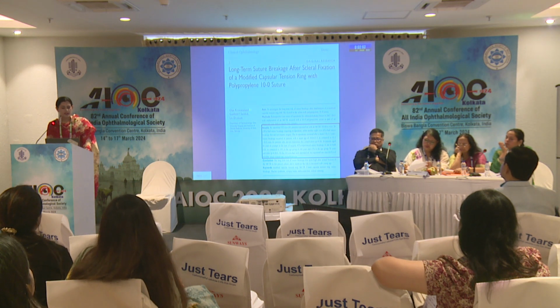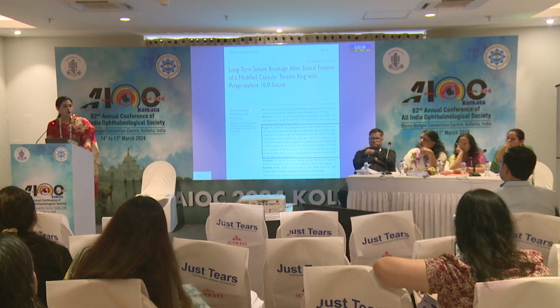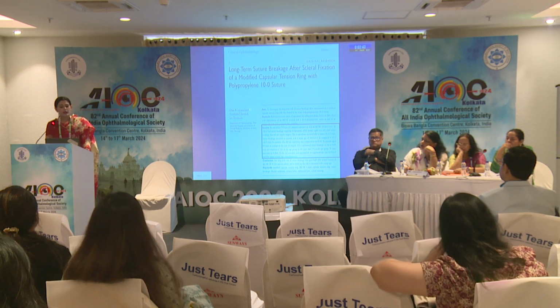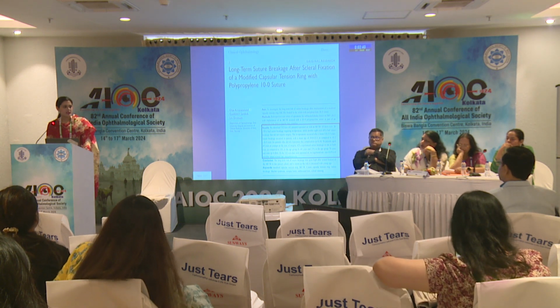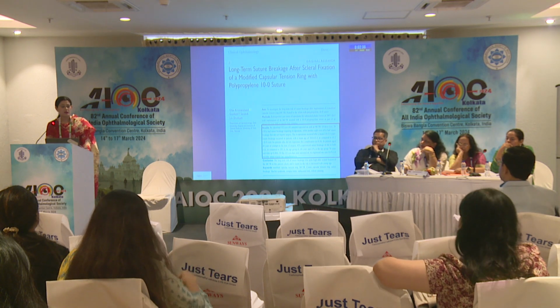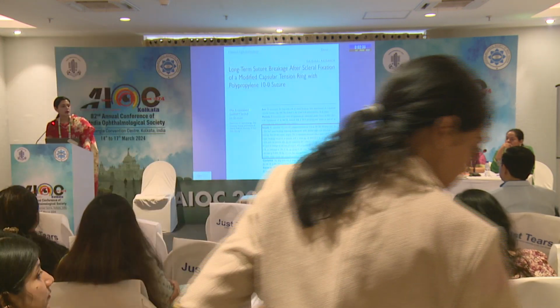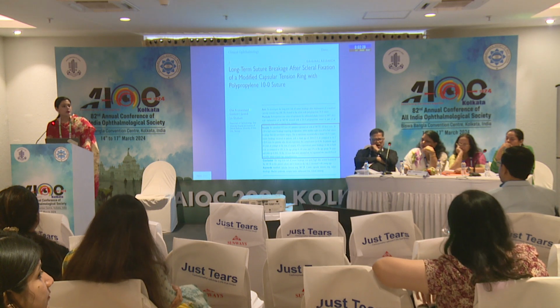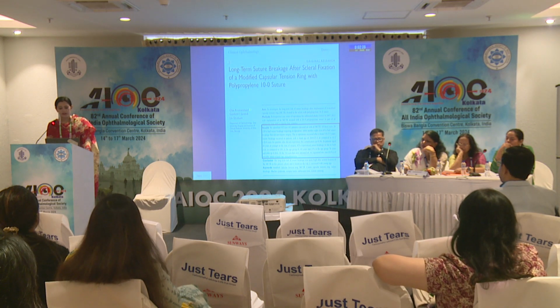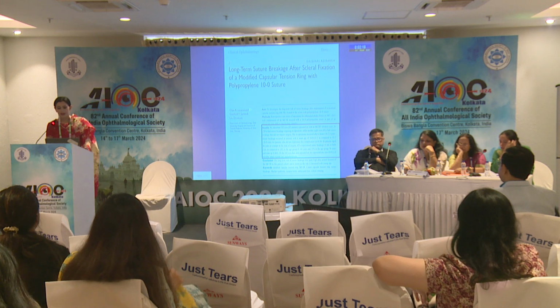Also, another major concern in these eyes has been the biodegradation of the suture material. Since this capsular bag is sutured to the scleral wall using the suture material, the degradation of this material can lead to late decentration. This is of grave importance because most of these patients are young patients with a very long lifespan ahead, and in addition they can have comorbidities such as Marfan's, homocystinuria, which predispose them to progressive zonular weakness. By now it is well established that 10-0 prolene undergoes biodegradation. Therefore, in our study we used 9-0 prolene.